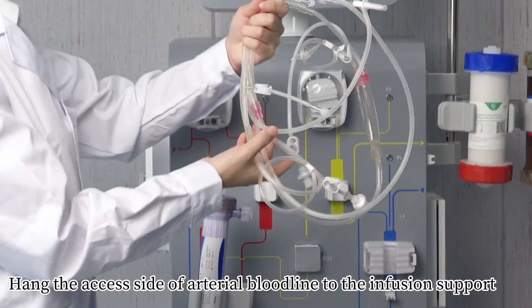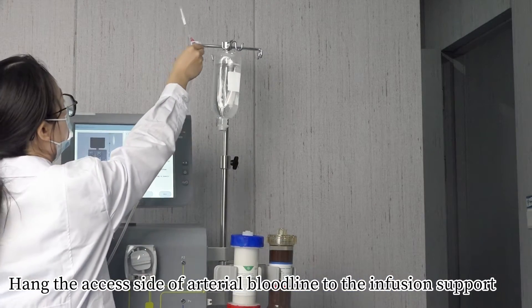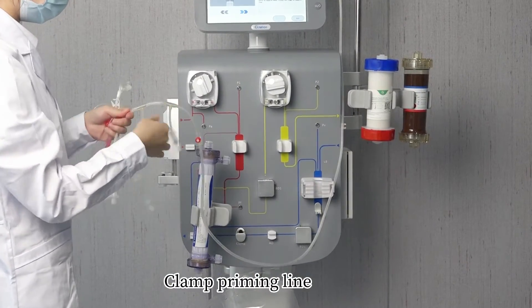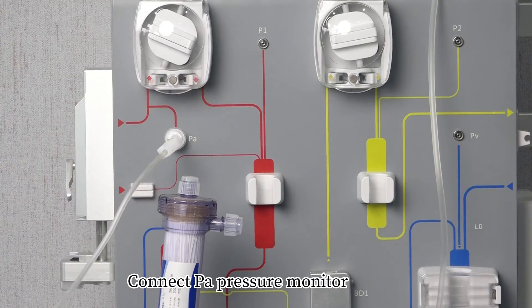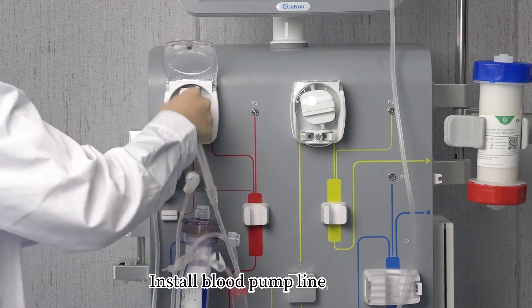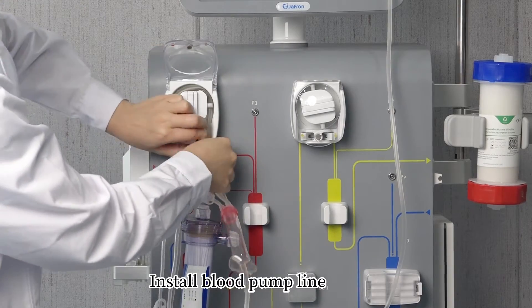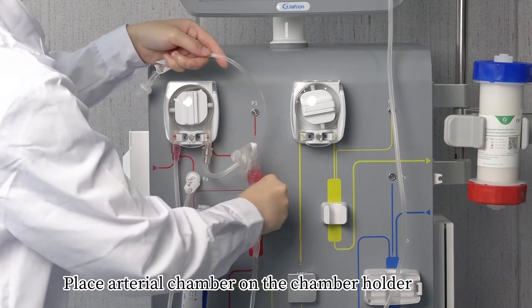Hang the excess side of the arterial bloodline on the infusion support. Clamp the priming line. Connect the PA pressure monitor. Install the blood pump. Place the arterial chamber on the chamber holder.